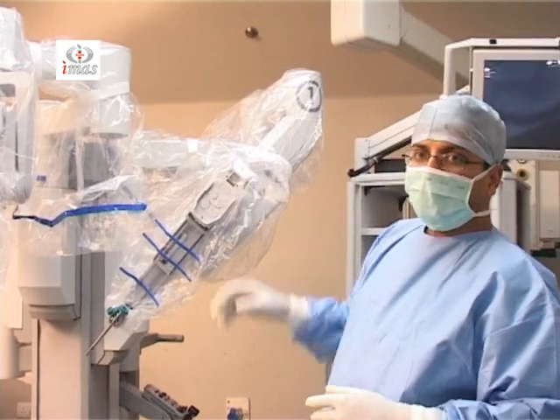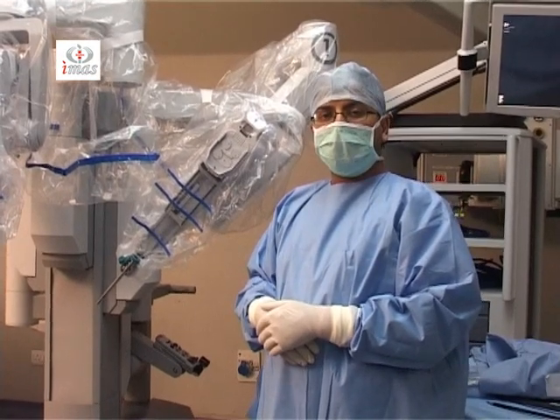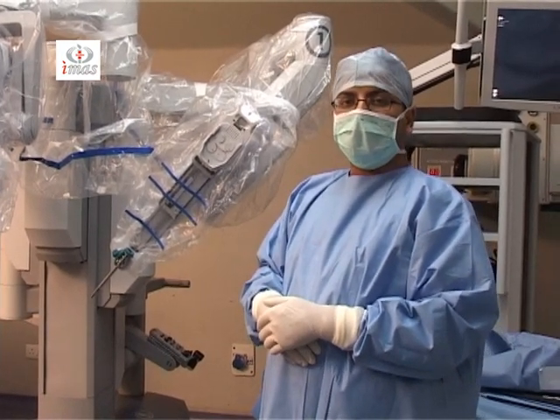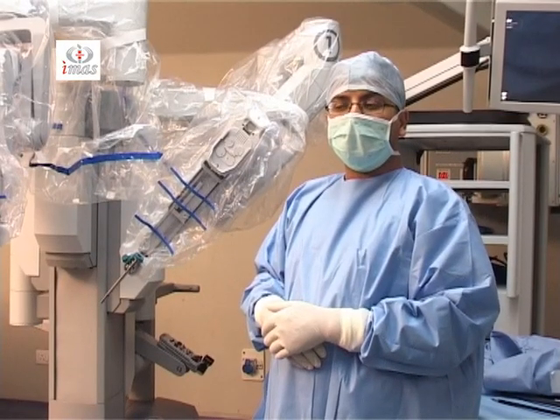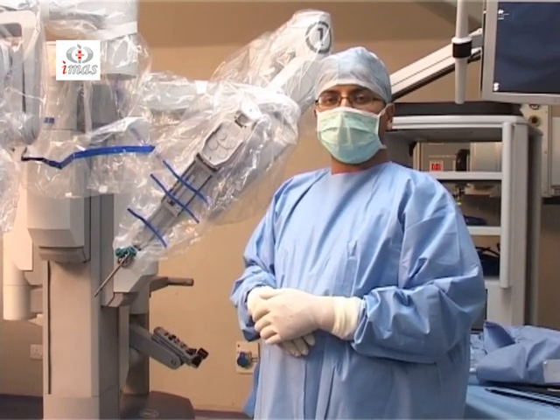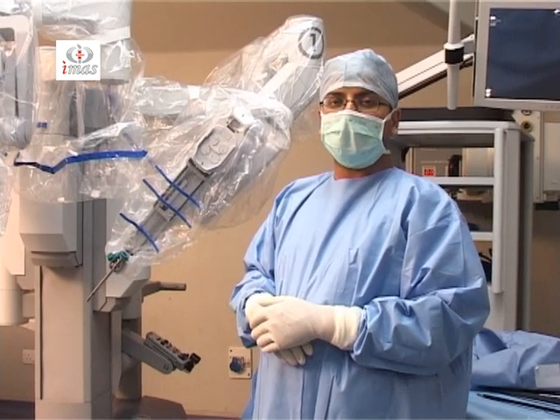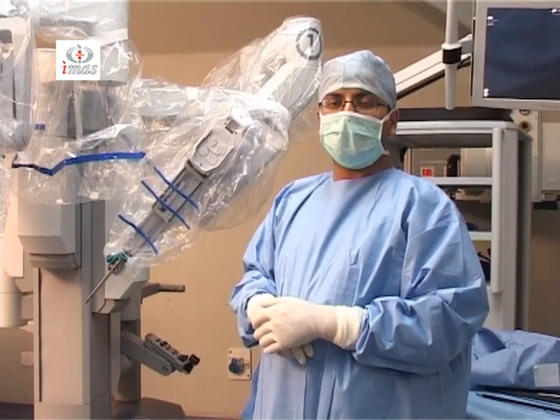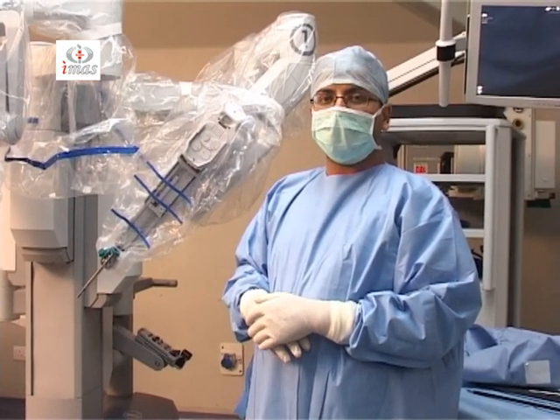So this technology provides us with many advantages like 3-dimensional stereoscopic vision, endo-wristed instruments providing 7 degrees of freedom, scaling of motion, precision because of filtration of physiological tremors, the remote center technology causing less port site trauma, a single surgeon capable of manipulating 4 arms including 1 camera arm and 3 instrument arms, the possibility of telesurgery, the surgeon sitting separately away from the patient, leading to better patient outcomes and more advances in surgery.